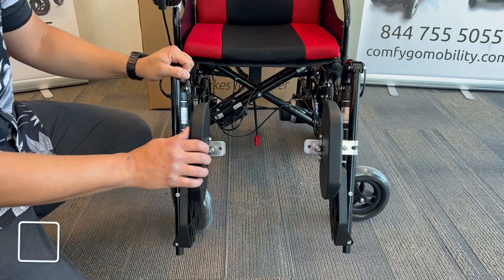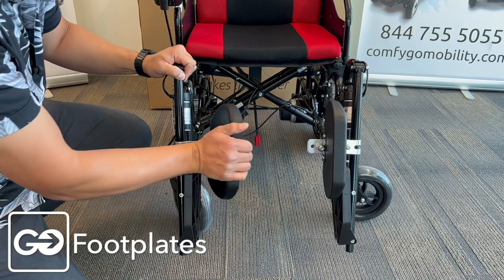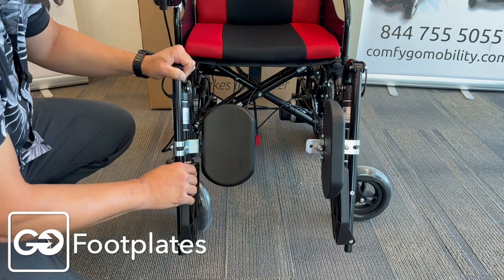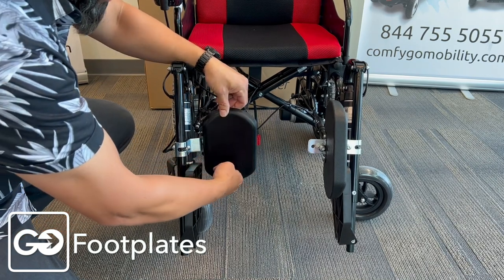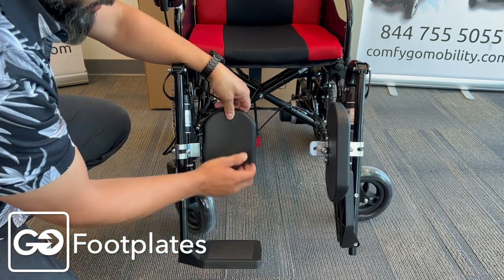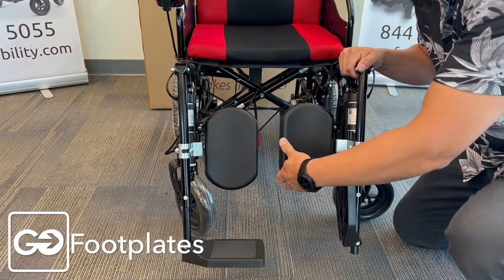Now we want to take a look at unfolding these footrests. Here's an important step: you want to push these back in this direction. You'll notice that this won't open up — you'll have a hard time. Take one more step: tilt this backwards a little bit right here, and then these will slide down very easily. Put those back in position and then you have your calf rest and your footplate.